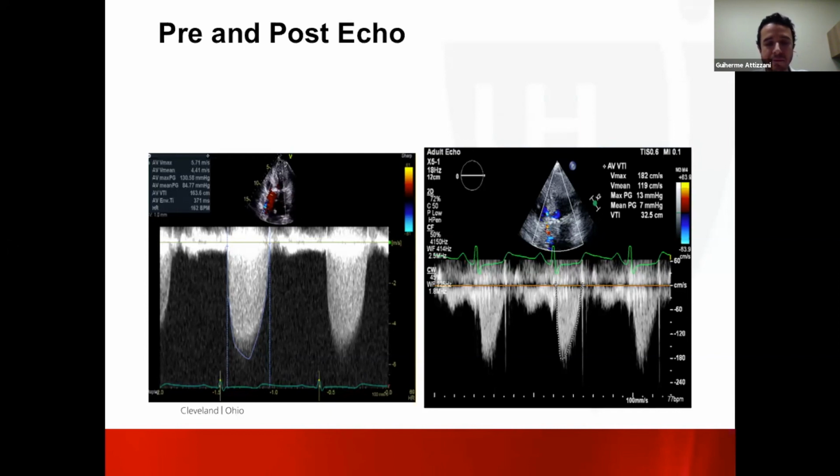But there's no data. I mean, I agree with all of you. We didn't post-dilate this valve, and there's really no data showing that this cosmetic post-dilatation that would theoretically improve the circularity of the frame would lead to better long-term outcomes.